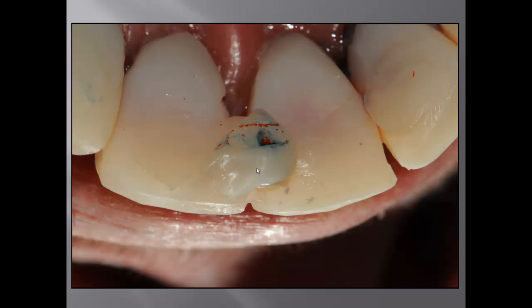So when I establish that the patient is deprogrammed, I'll go to the next step. I'll put another composite material. While it's soft, I'll ask the patient to bite down. And when the patient bites down and keeps the mouth closed, I will cure this composite and lock the jaw in that position. So every time I take an impression or bite registration material, I know I will establish a repeatable bite.